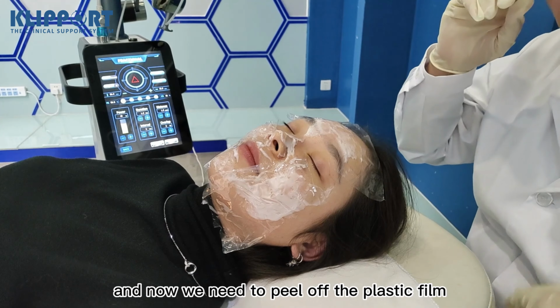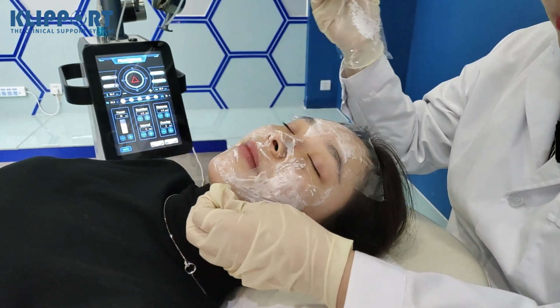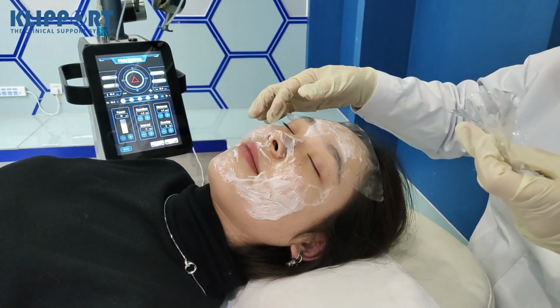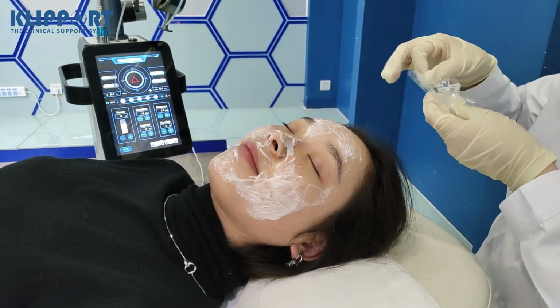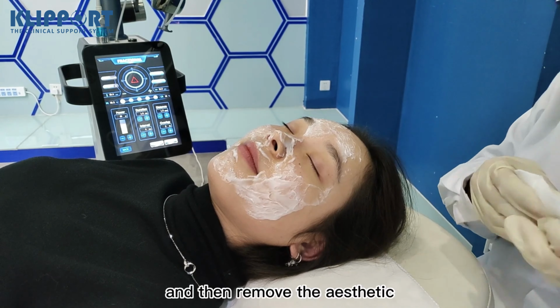And now we need to peel off the plastic film. And then remove the anesthetic.